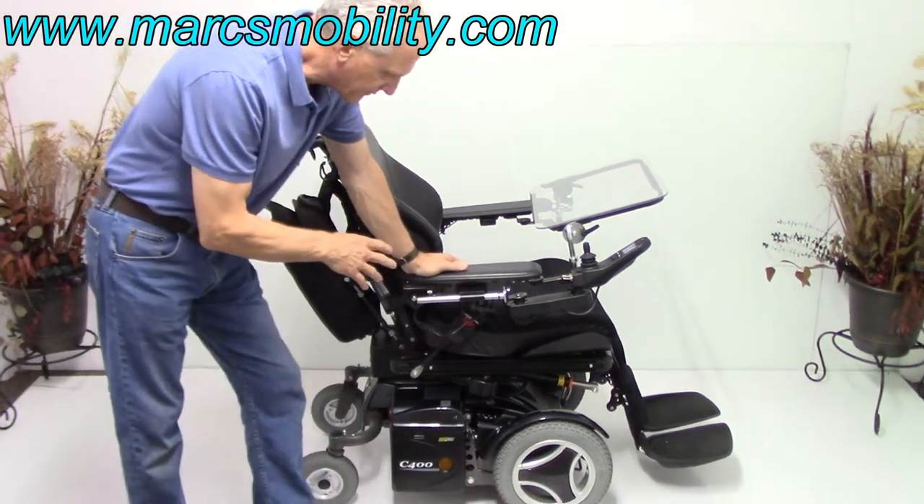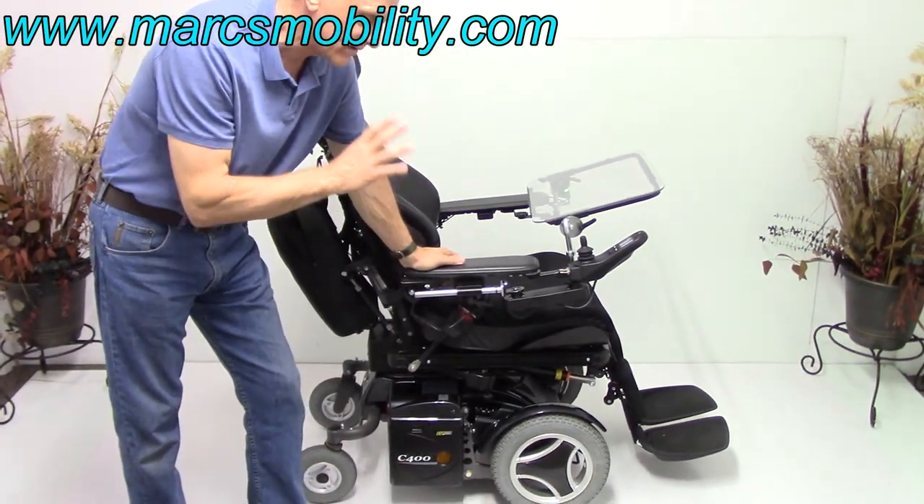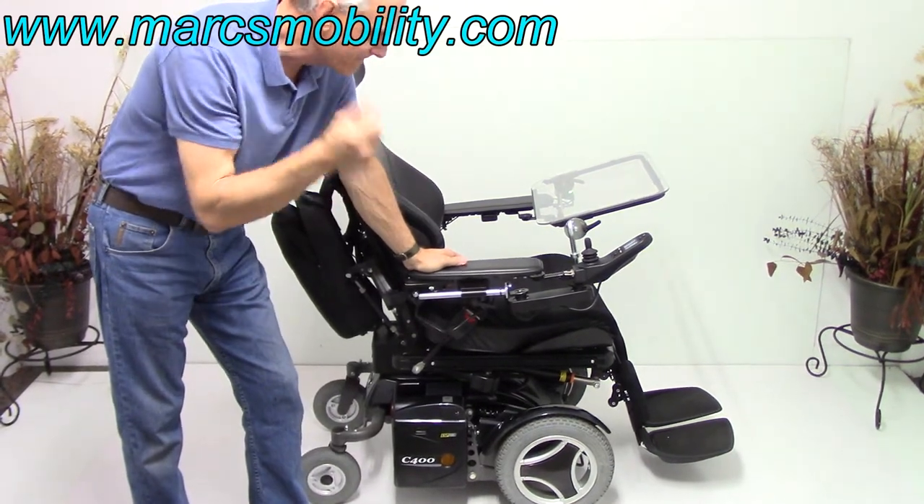This chair is 3 to 4 years old but it only has 12 miles on it, so it's practically new — 12 miles is less than a month of use.